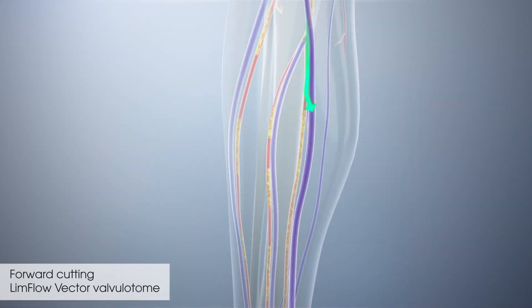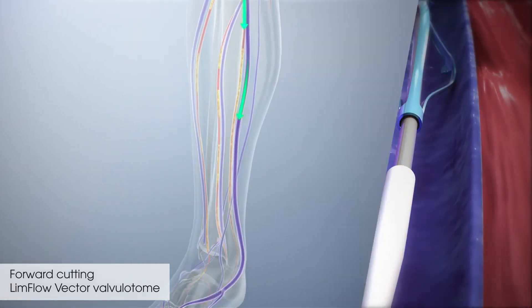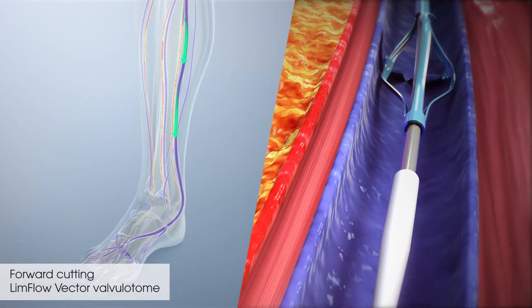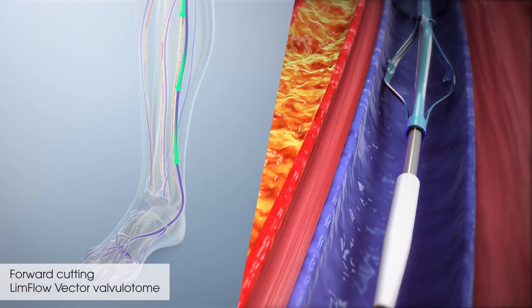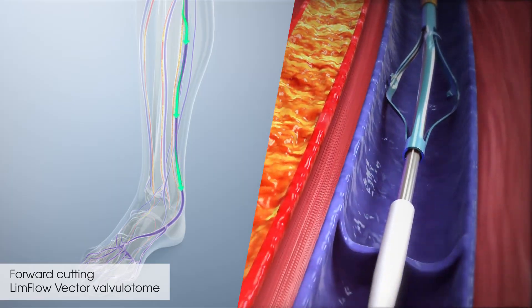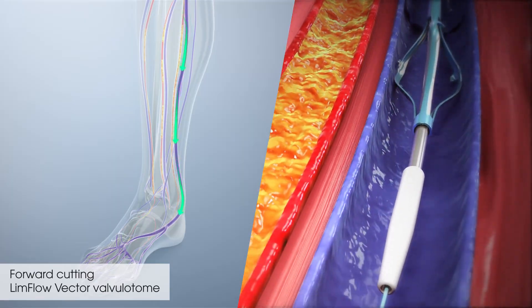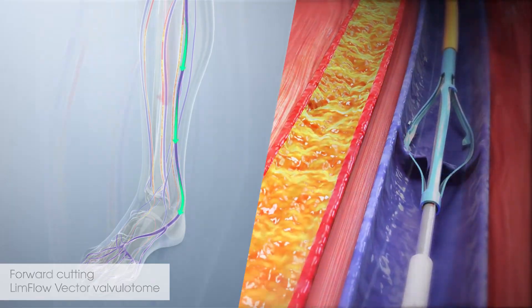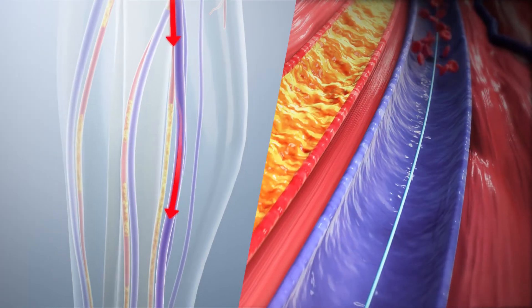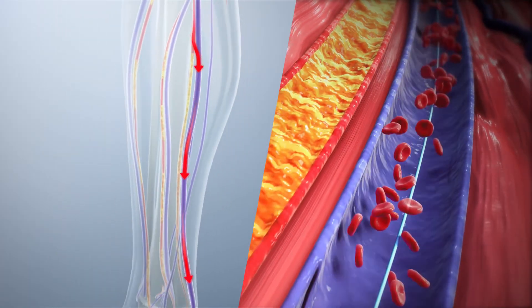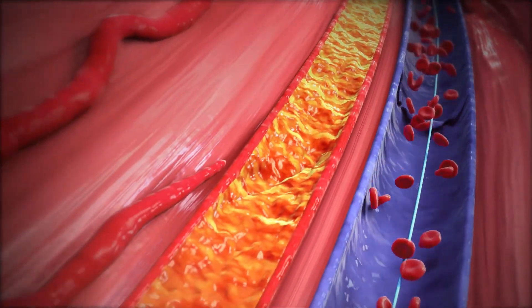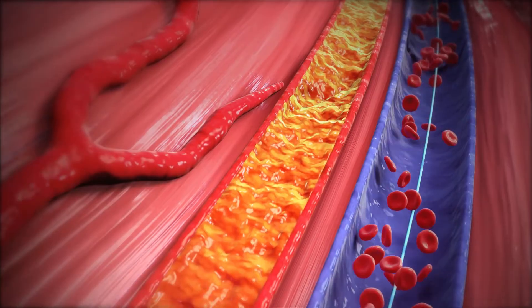The forward-cutting LimFlow Vector valvulotome is inserted through the arterial access and, by advancing it below the crossing point and into the foot, it renders the venous valves incompetent. This allows reversal of flow in the veins, bringing oxygenated blood to the foot.